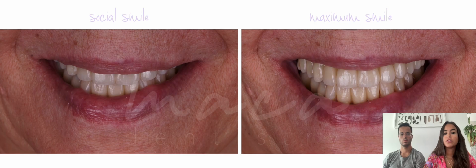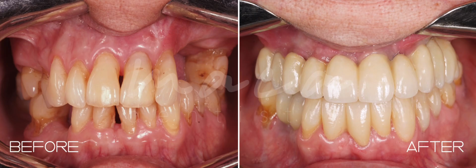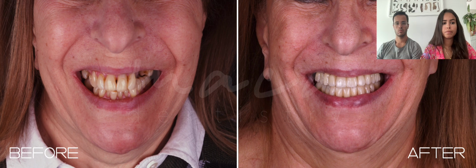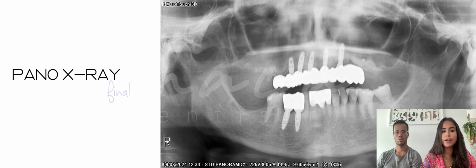Here we have the close-up pictures, a social smile and also a maximum smile. We can appreciate that the reduced number of teeth does not compromise the aesthetics of our smile. And now some before and after pictures, first on a front view, then occlusal view, and the extraoral pictures. Finally, the final panoramic X-ray.